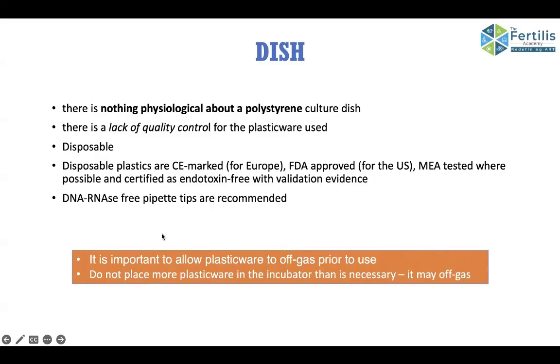It is important to allow the plasticware to off gas before you start using it. And do not place extra plasticware in the incubator. Many times I've seen that people just load the incubators with dishes. When we go to work, they have already kept some 15-20 dishes in the incubator and they ask us to use the same dishes which they have opened. But there is no point in opening these dishes, because if you load your incubator with plastics, you might not have off-gassed it sufficiently outside. So it will off gas inside the incubator and it will spoil the culture conditions, which we don't want.